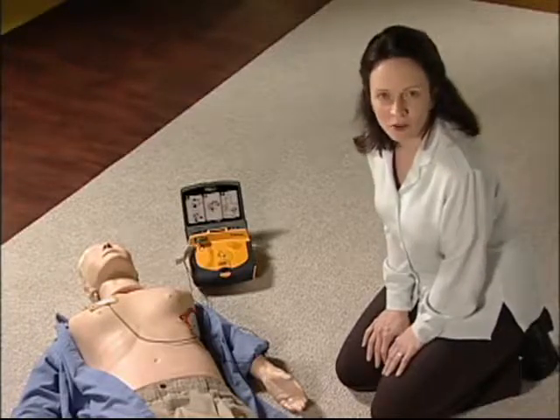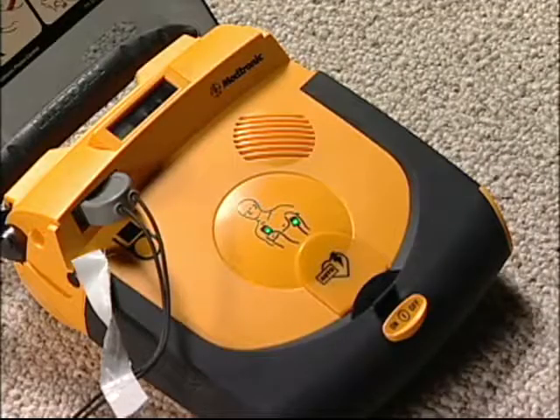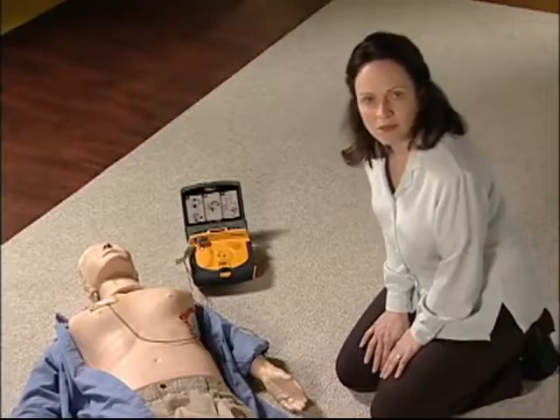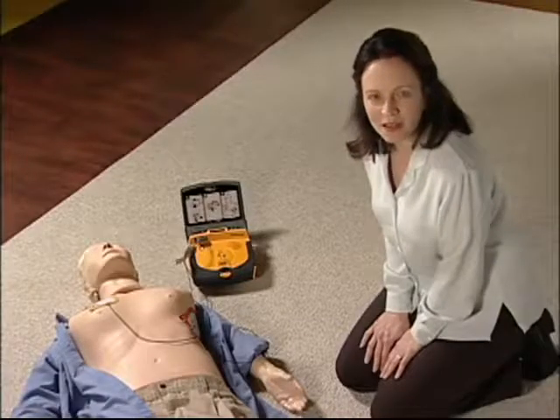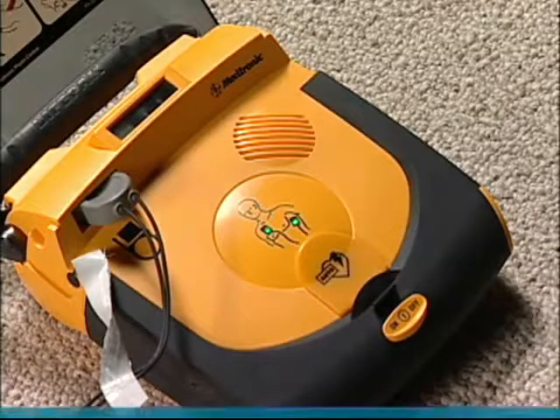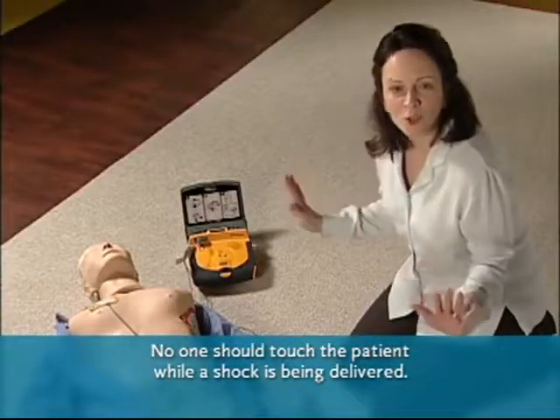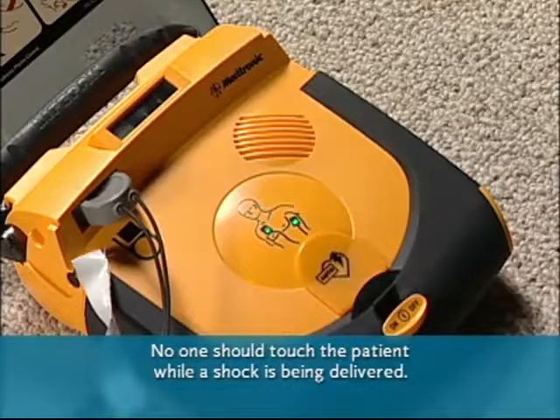If it detects a heart rhythm that needs a shock, it will say, Stand by. Preparing to shock. It charges automatically. Wait until it says, Everyone clear. Do not touch patient. Delivering shock. Make sure no one is touching the patient.